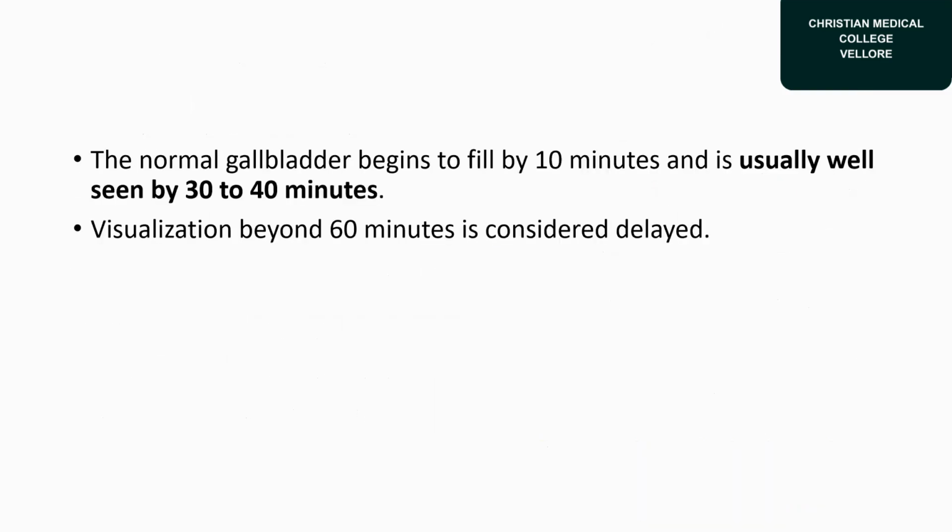Normally the gallbladder is supposed to start filling by about 10 minutes, and it's usually seen in 30 to 40 minutes. And we give a time, and in these cases, it can take up to 60 minutes. But after 60 minutes, it's considered delayed visualization.